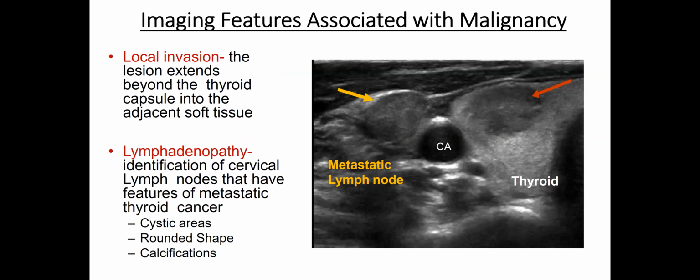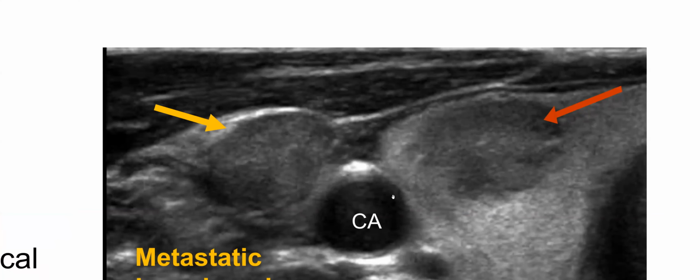Now, this is a case of a slam dunk, right away callable as thyroid carcinoma. Why is that? Because if you look at this, this is the thyroid gland here, that's the isthmus, this is the carotid artery, this is the skeletal muscle, and you see this nodule which is hypoechoic, that means it's darker as compared to the surrounding thyroid, which is more isoechoic. That is very typical of cancer, and you see also here irregular margins.